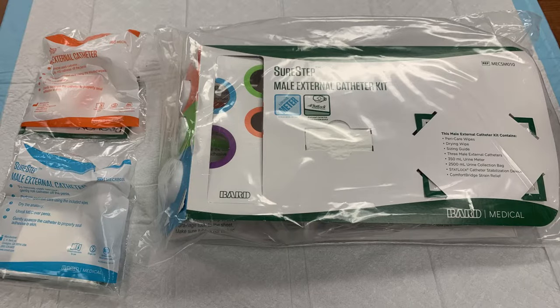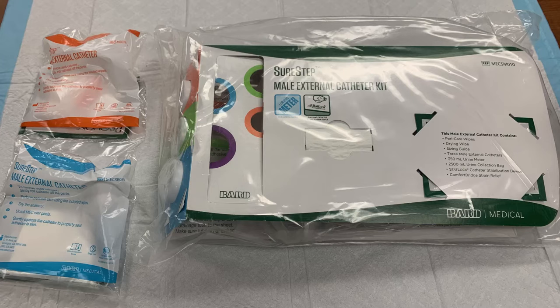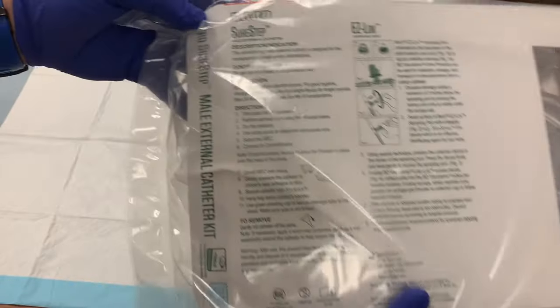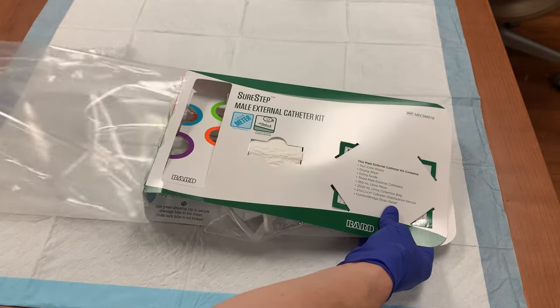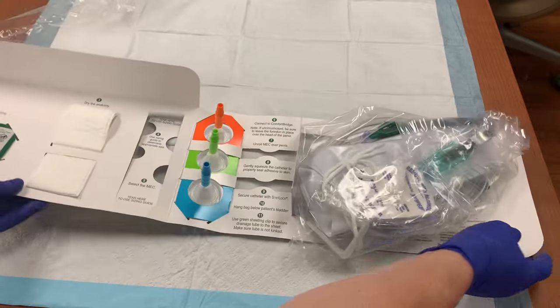The SureStep Kit provides you with everything you will need to place the condom catheter, including three sizes of catheter, the drainage bag, and a stat lock. The catheter will need to be replaced daily at a minimum, so individual replacement catheters are also available. On the back of the kit there is an explanation of the contents and directions for use. The packaging is perforated for easy opening, and when you open the kit, you will see the contents laid out in an organized, step-by-step system, much like other SureStep Kits.